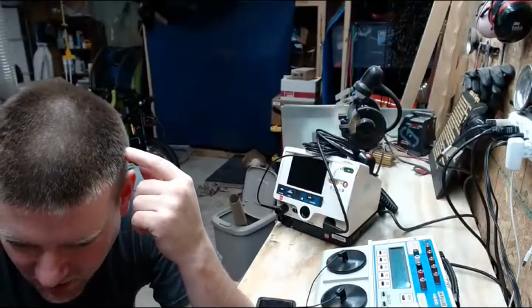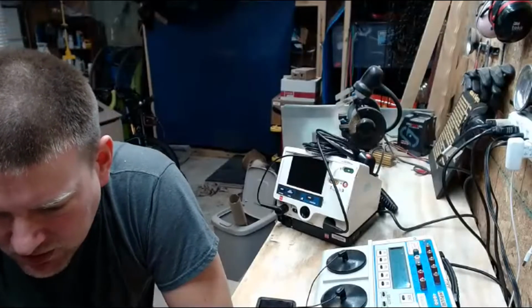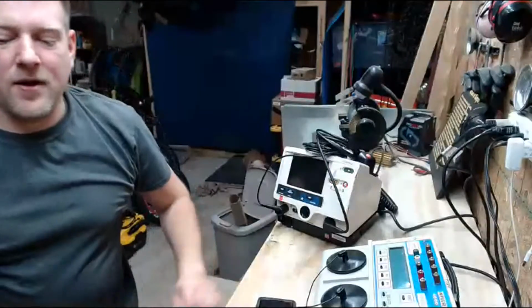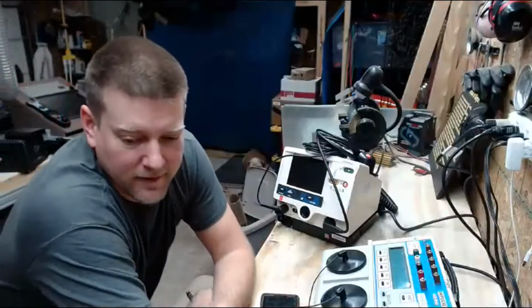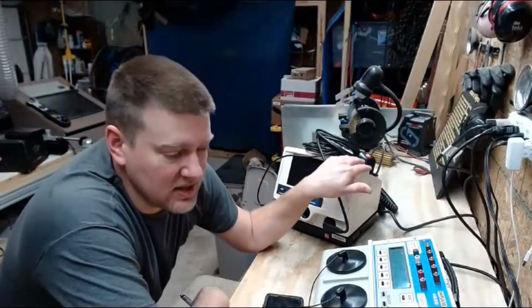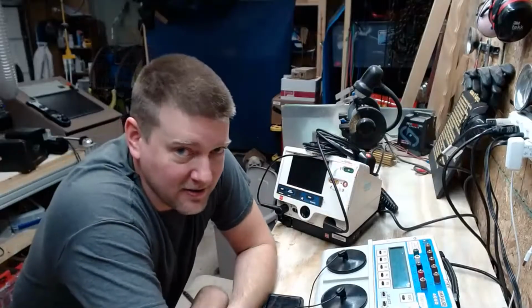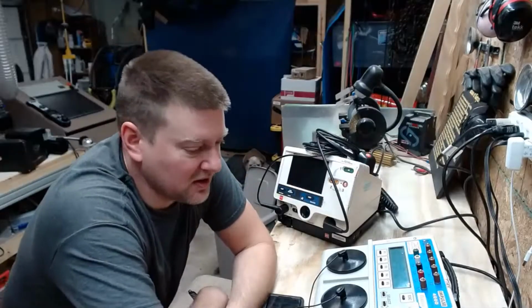Oh my gosh, there's so much stuff here, guys. Are you following manufacturer procedure and recording values, or just departmental procedures and checklists? Ryan, that is a very, very good question. Manufacturers of these devices have checklists, and it's in your manual. I highly suggest you only follow the checklist.